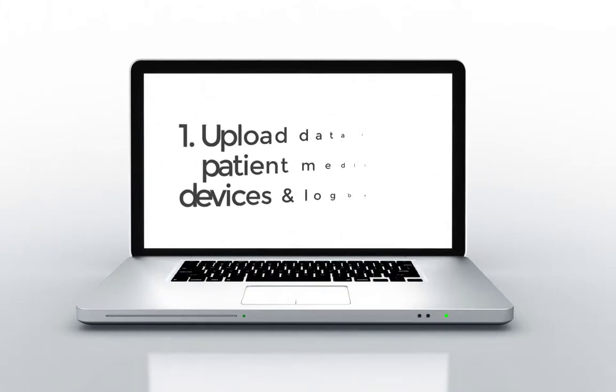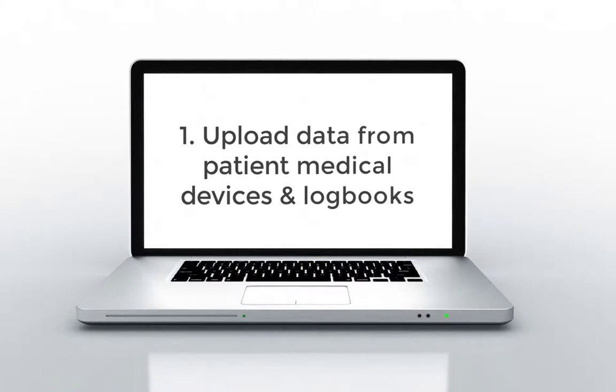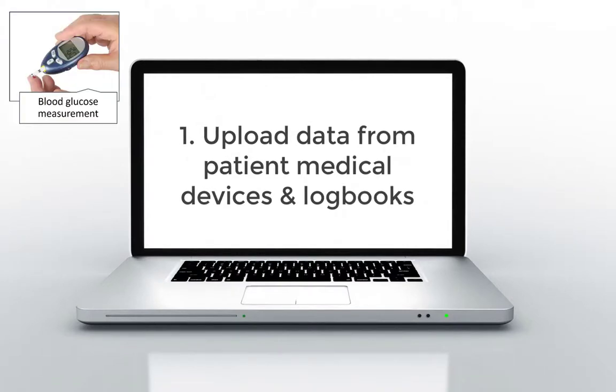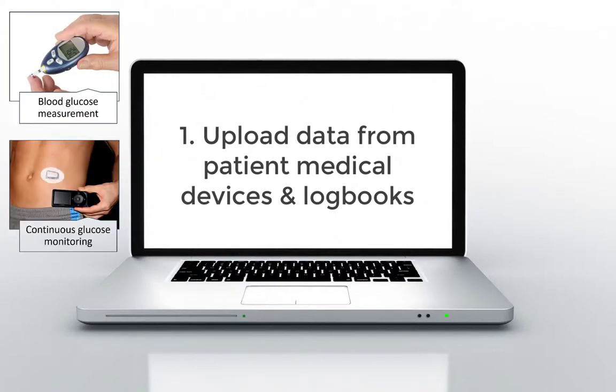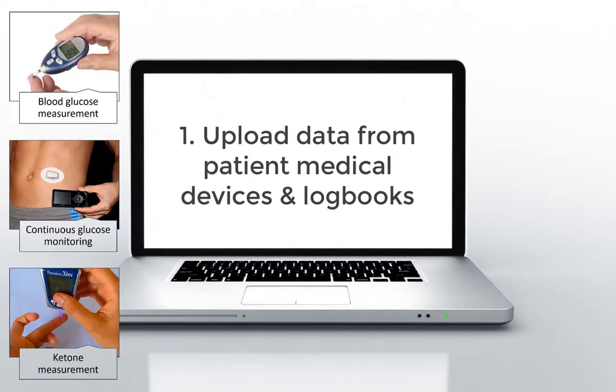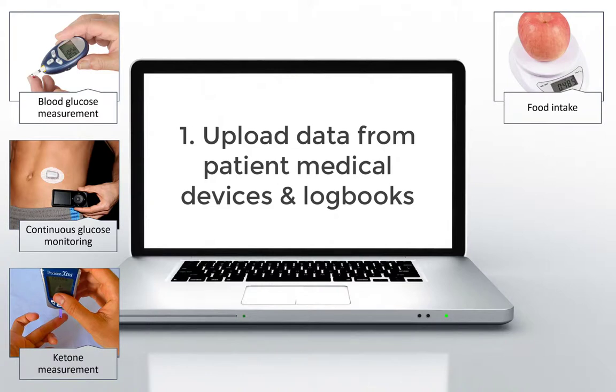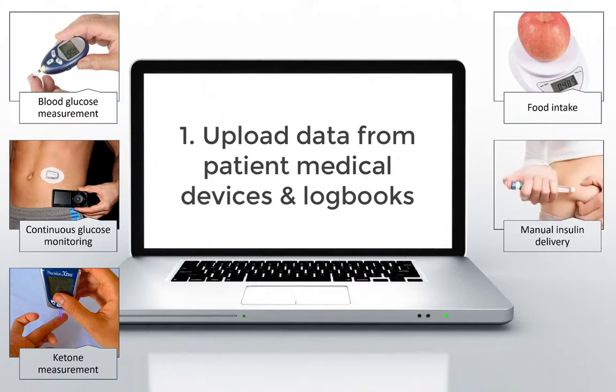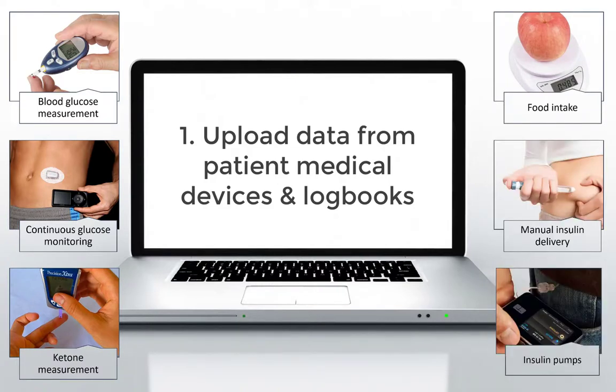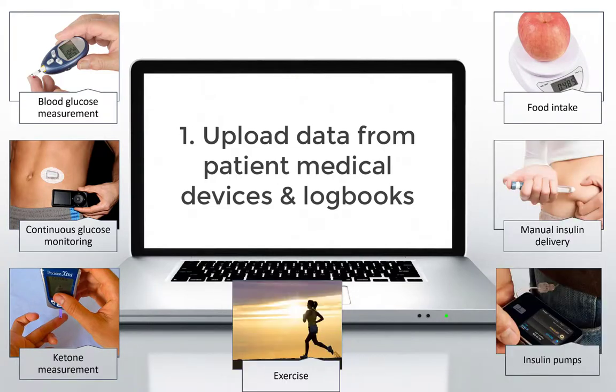Step 1 is to upload data from patient medical devices and logbooks, including blood glucose meters, continuous glucose monitors, ketone meters, food logs, insulin delivered manually or by pump, and exercise logs.